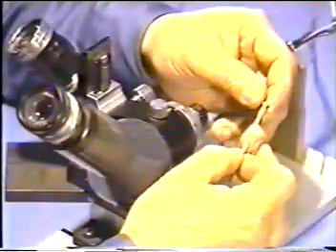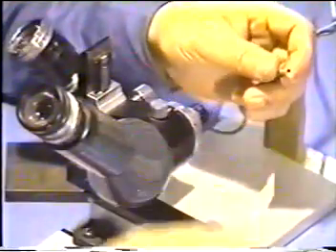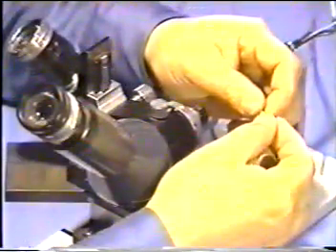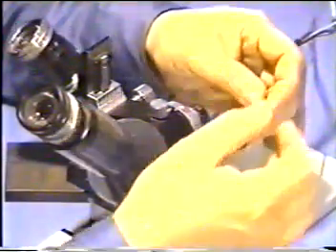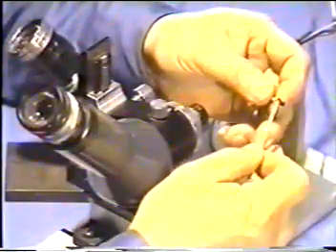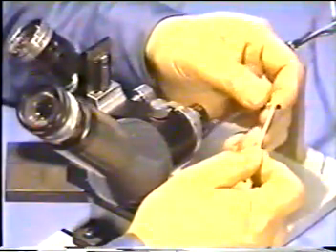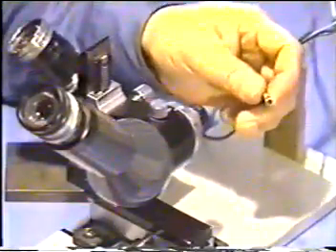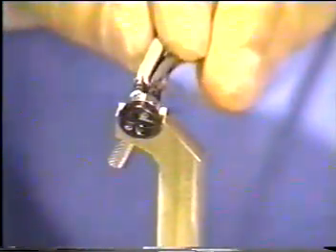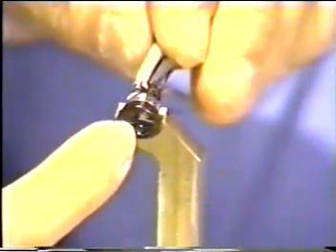Apply K445B on the tip of IG. Make sure the tip surface of IG is clean. Insert IG into DEL and apply K445B around DEL as well. The surface of DTA should be flush with DEL. The end of DEL must not be recessed.